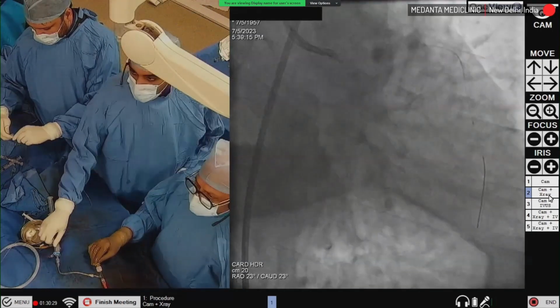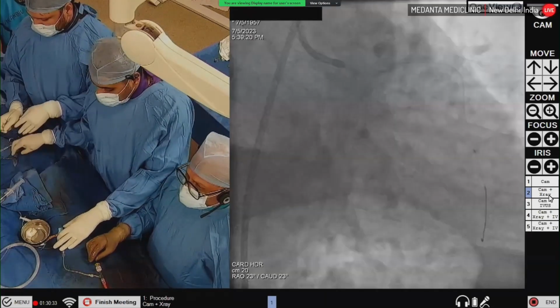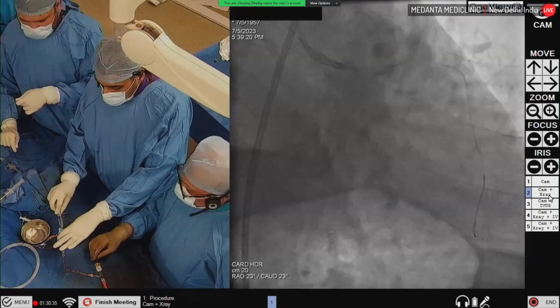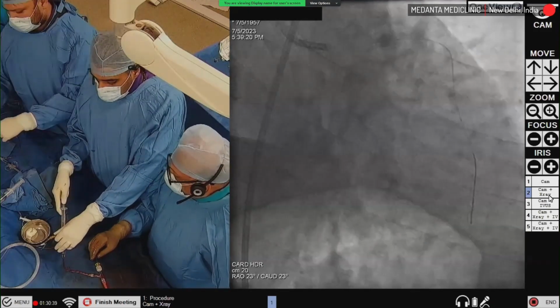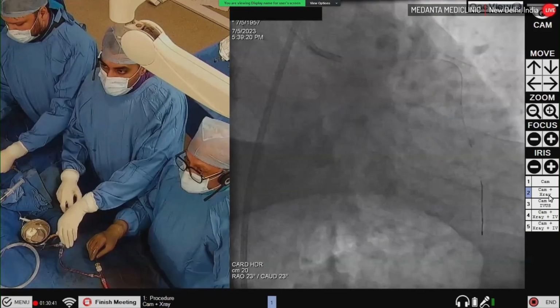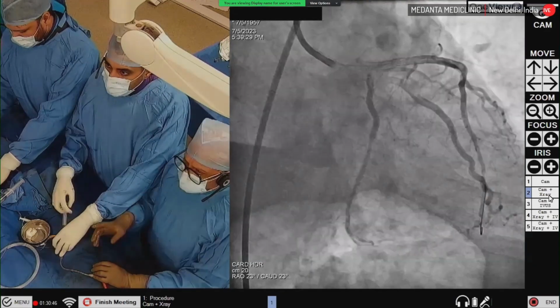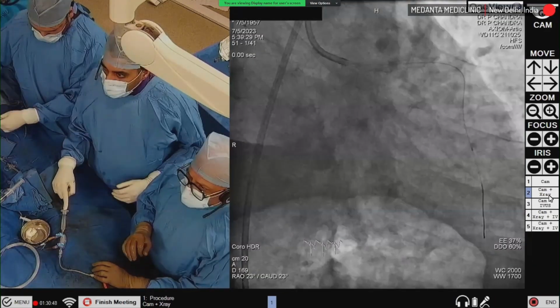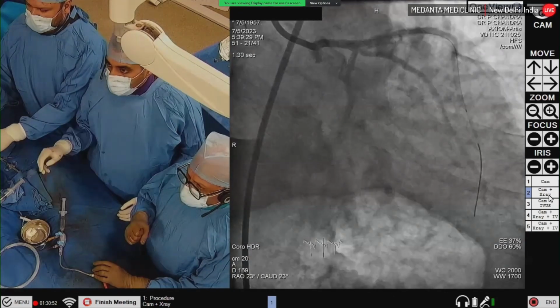Can we do a check shot? So let's do a check. No, not with this. Check. This is something which we have seen with these BMW coatings sometimes. I think this looks quite nice. The staining is completely finished and looks quite good.